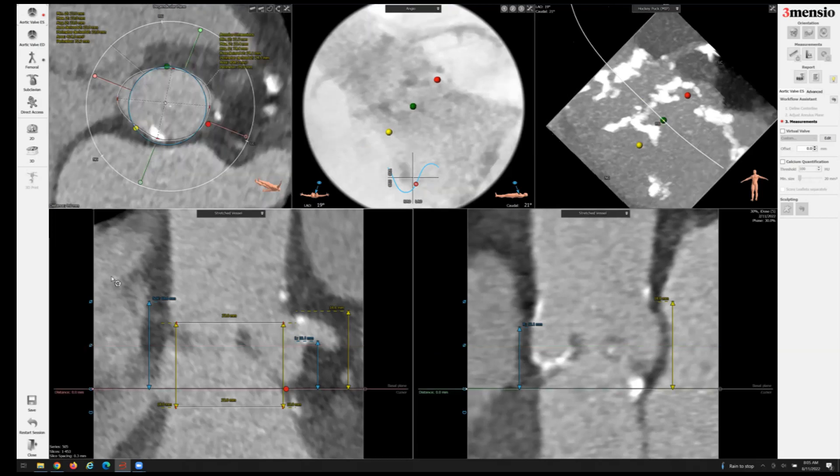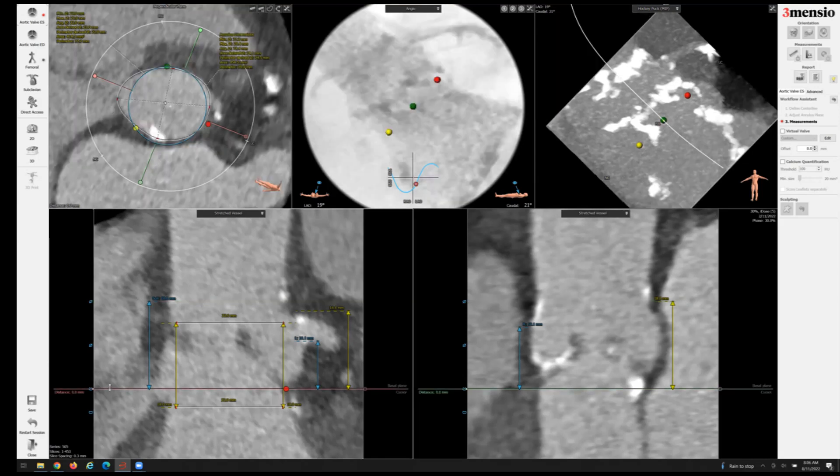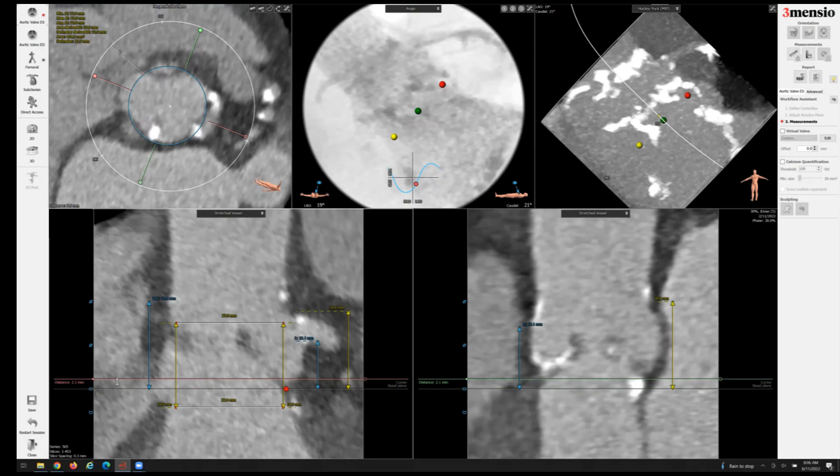Looking at the annular dimensions, the area is around 454 millimeters squared and the perimeter is around 77 millimeters. From a valve sizing standpoint, if using a balloon-expandable valve, you would consider either a 23-millimeter with added volume, or a 26-millimeter with perhaps subtracted volume. The mean diameter ranges between 24 to 24.5 millimeters, so a 26-millimeter balloon-expandable valve might be a little too oversized. Also note the sinotubular junction is only 23.6 millimeters, and there is a chunk of annular calcium at the base.